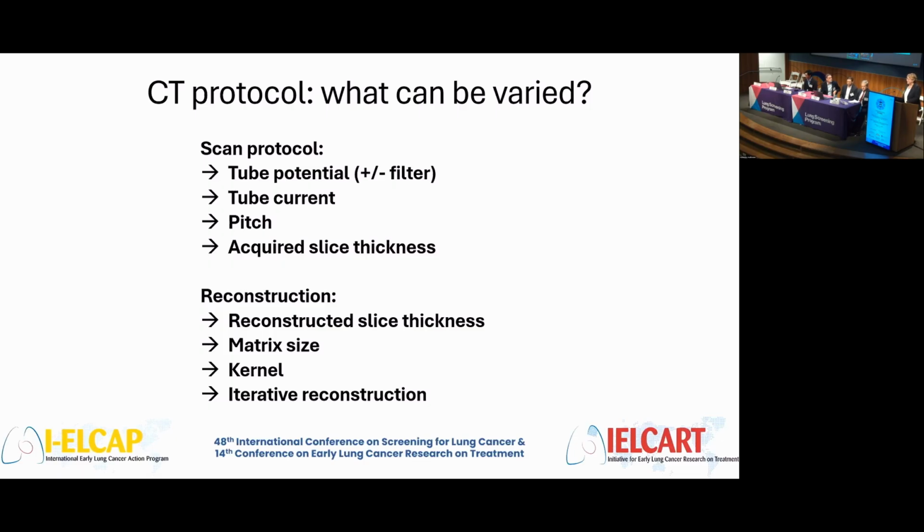Probably already within 5 to 10 years, there will be a trend towards much more availability of photon counting CT. So we have loads of different variations that we could envision already now that relate either to the scan protocol or to the reconstruction. With relation to reconstruction, you can do a lot of work even with existing data, with participant scans, but we cannot continuously add acquisitions to standardize and validate new protocols using screenees because of the radiation dose. And that's where phantoms come in.